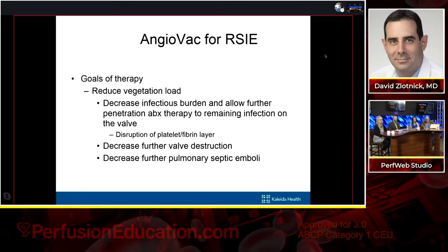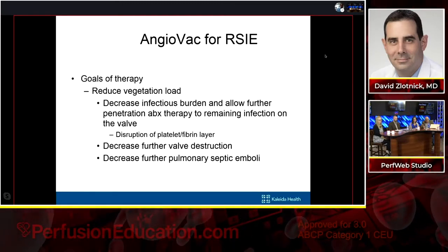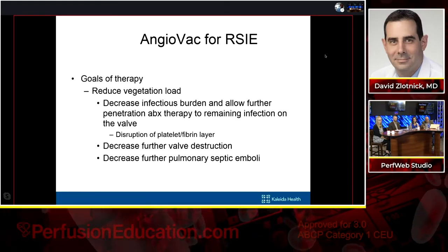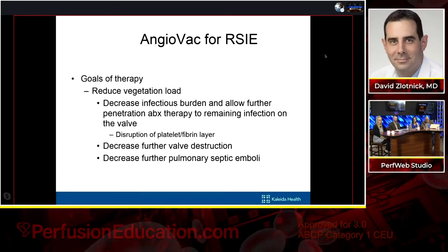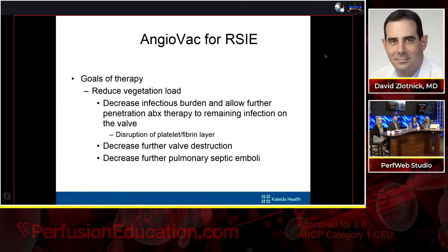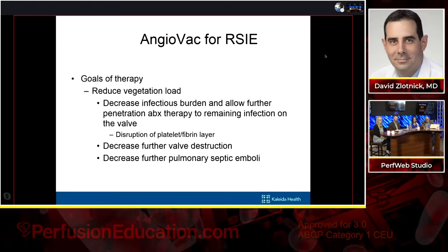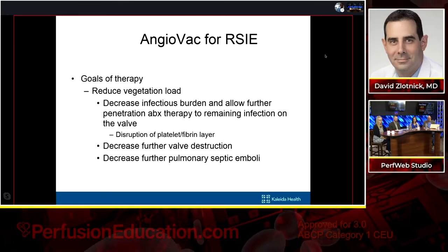And I think this is really where AngioVac takes off, because the goal of therapy for AngioVac is what we want to do is reduce the vegetative load on the valve or in the right heart. And this allows us to decrease the infectious burden, get rid of that platelet fibrin cap on the vegetation, and allow the antibiotics that are being given to clear up the remaining infection. So we're not trying to go in there and completely clear the valve of all the infection. We want to debulk. We like to say that a successful debulking is if we can get 60% or more of the vegetative load off the valve. And what we're really trying to do is just strip that platelet fibrin cap and allow the body's immune system and the antibiotics to really resolve the rest of it.